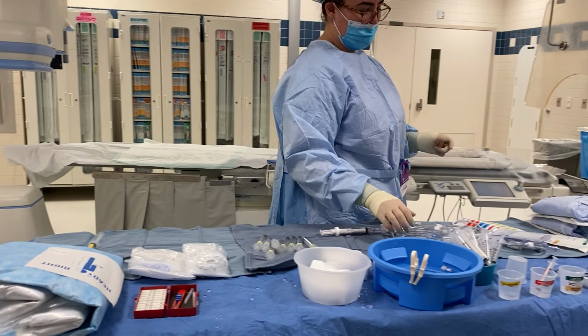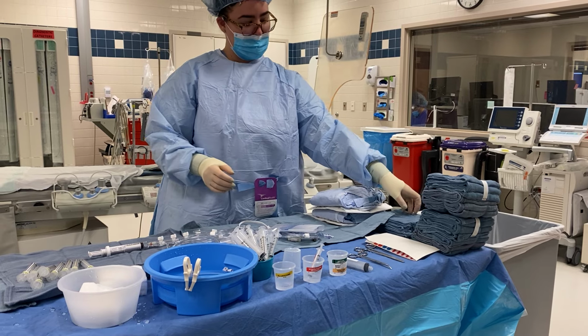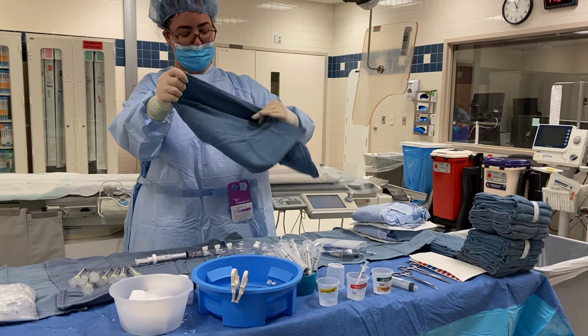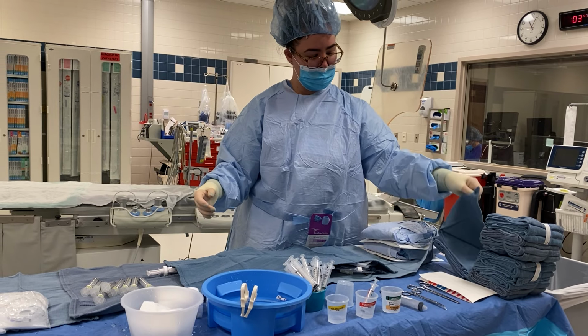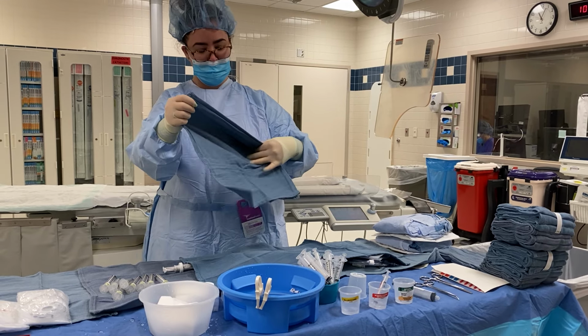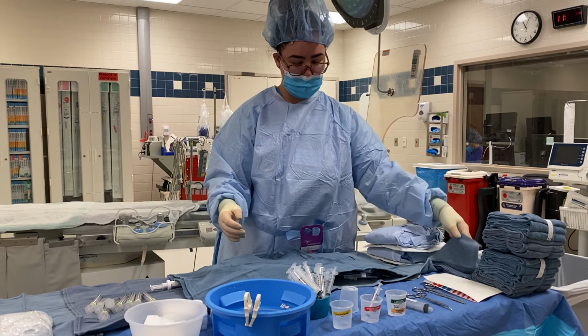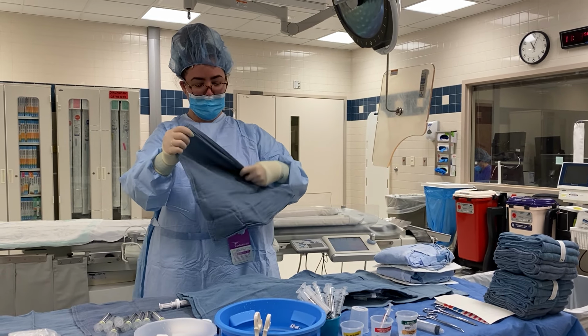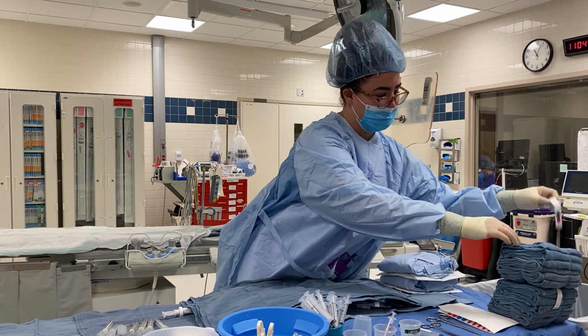And then the last and final step that I like to do, but is not necessary, is I like to take a couple towels and unfold them and just have a little pile, because once it comes time to draping the patient, once the drape is on, I like to put a couple towels because it just helps keep everything extra clean. So this is just gonna save time once it comes time to set the patient up.